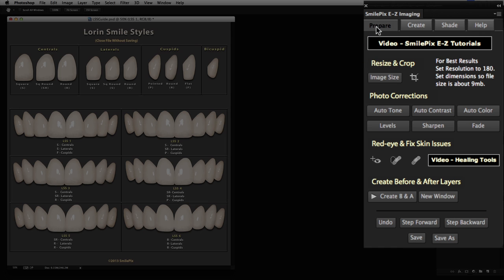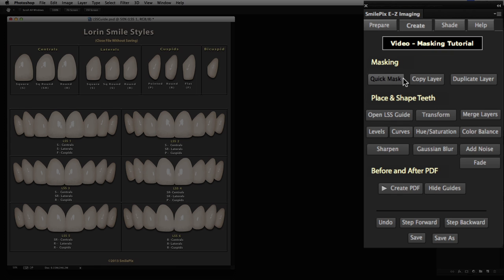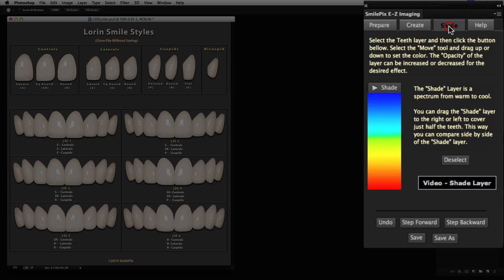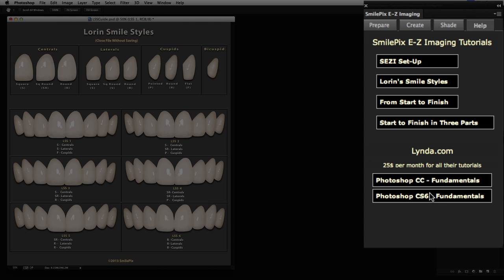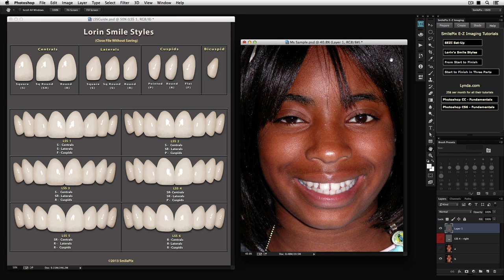The Prepare tab helps you get your photo ready for the simulation. The Create tab has most of the common commands you would use in the creation of the simulation, so you do not have to hunt all over Photoshop for the correct command. The Shade tab allows you to adjust the shade of your smile creation, and the Help tab has links to online tutorials.